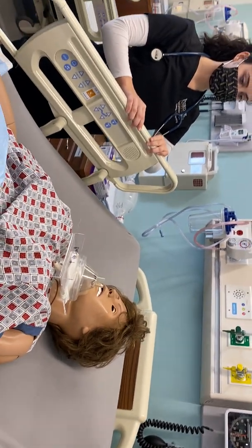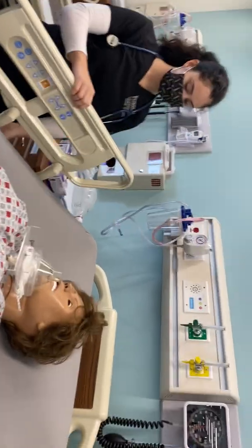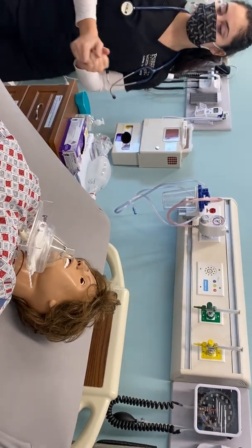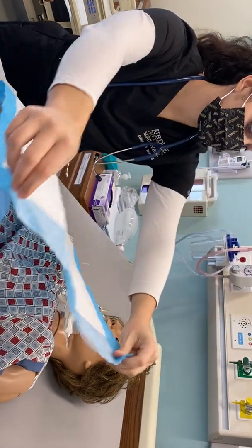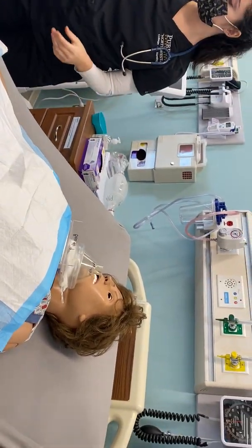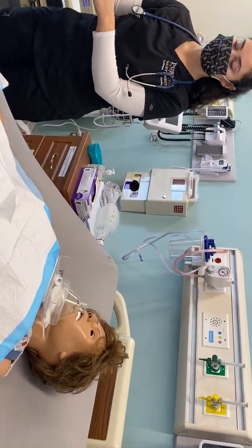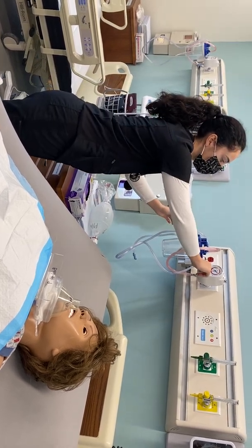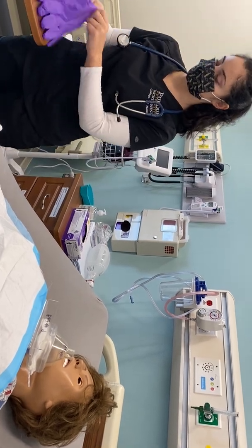Okay. All right, we're at a semi-Fowler's position. Perfect. So I'm going to do hand hygiene. Okay, I'm going to place the drape on you. It should go right below your chin. Okay. All right, now that we have done that, you know what, Mr. Jackson, I'm also going to be setting this to 150 mmHg. While we're waiting for that to start up, I am going to put my gloves on.